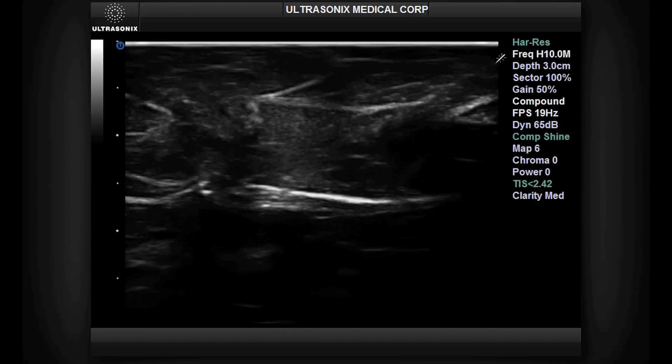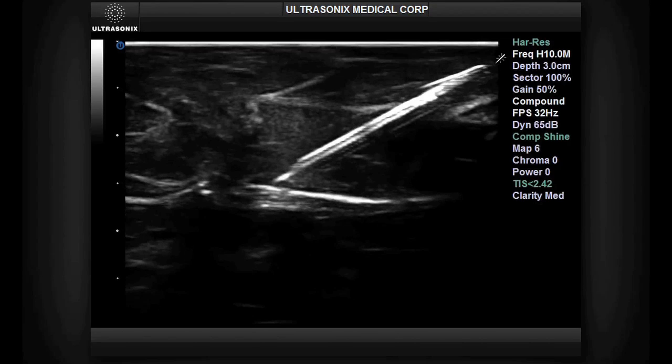During the procedure, when the needle is in-plane with the ultrasound image, you will see it appear clearly in the tissue.